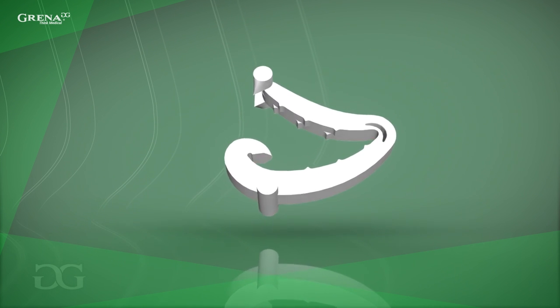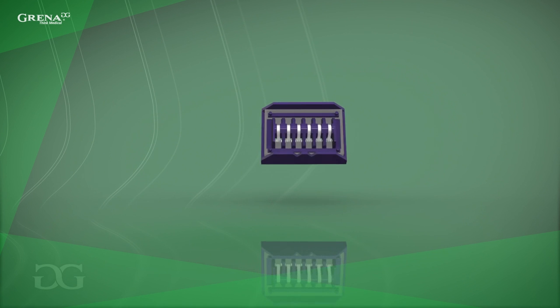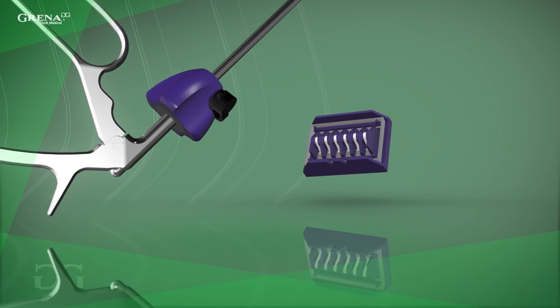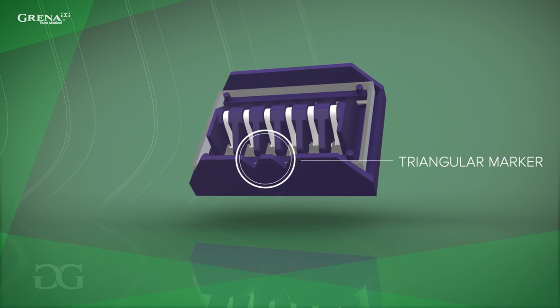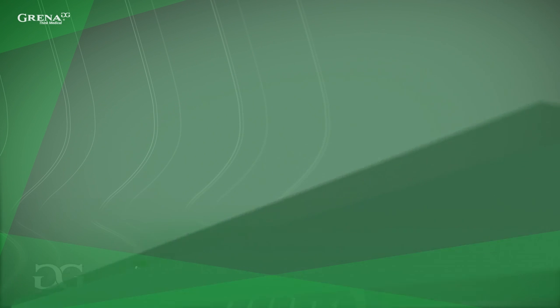To properly apply the polymer clip in the Click-A-V clip applier, first choose the appropriate size of the clip. It is important to have an appropriate device matching the color code of the cartridge. Then, remove the cartridge from the single packaging and place it on a sterile surface. Each cartridge has a triangular marker that presents the orientation of the clip after loading to the applier.